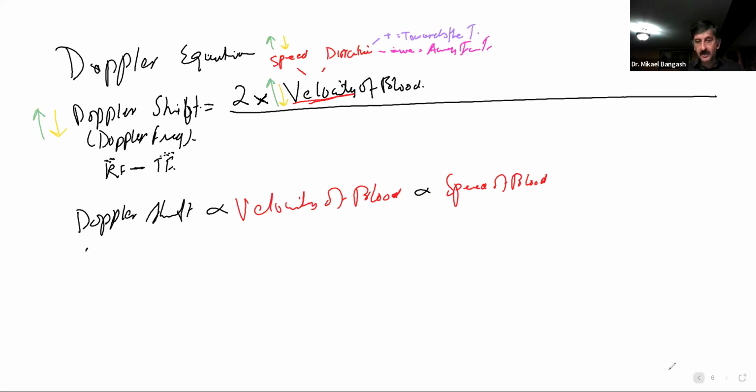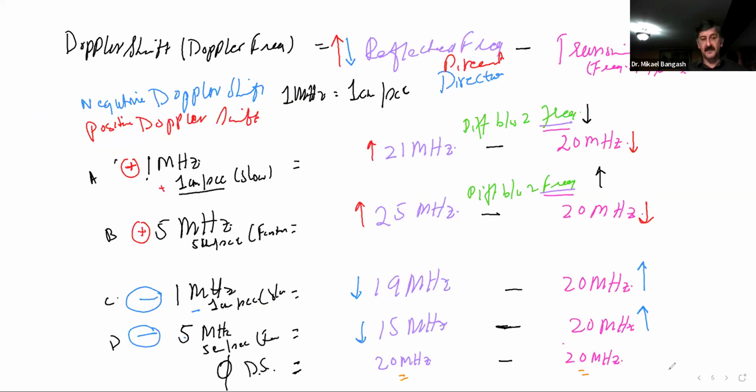What I pretty much just proved on my previous slide that you see here: the case where we had a low speed, whether it was positive or negative, mainly gave us a low Doppler shift frequency, compared to where we had a great speed, positive or negative, which mainly gave us a great Doppler shift.